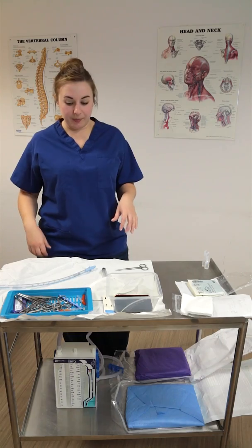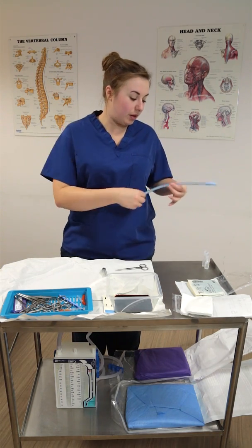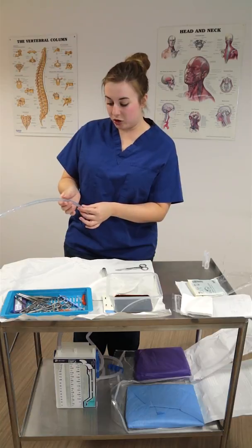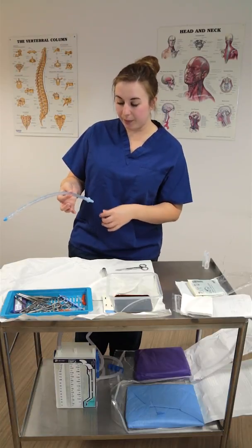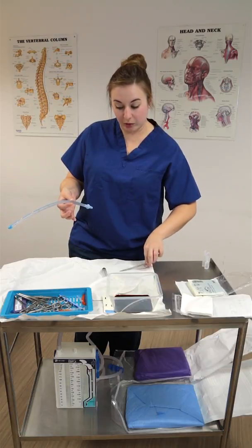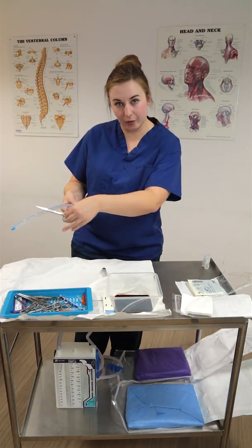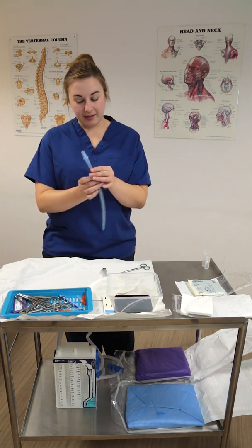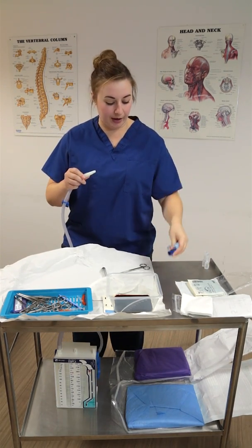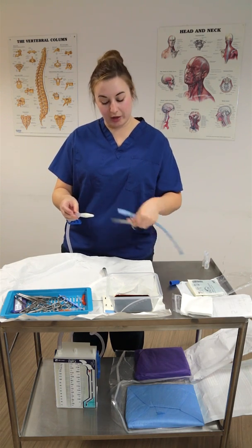When assisting, set the scissors to one side. Once the drain is in the pleural cavity it isn't anchored until it's sutured, so the doctor will probably ask you to lightly hold the end of the drain with your gloved hand to keep it in place while they start suturing. When they're suturing it's difficult to cut at the same time, so they'll ask you to hold the scissors and cut the suture when prompted. Also note that the drain end and the bottle end don't connect directly — you need to cut the end of the chest drain off and it will then slot in.